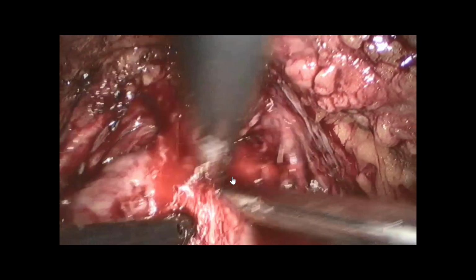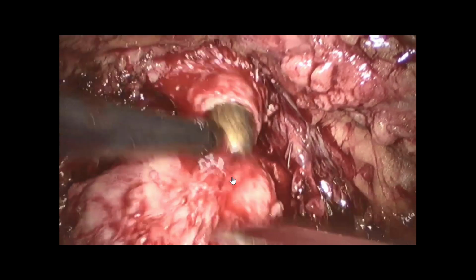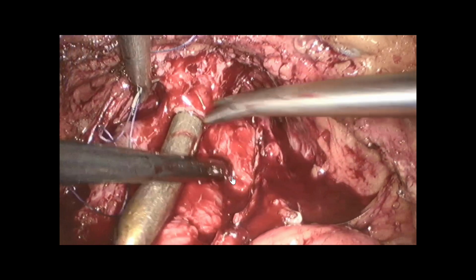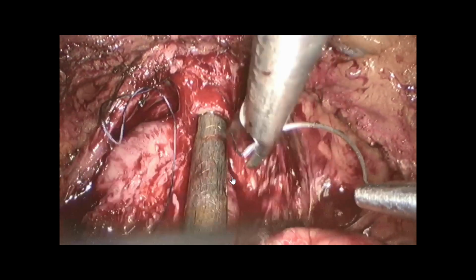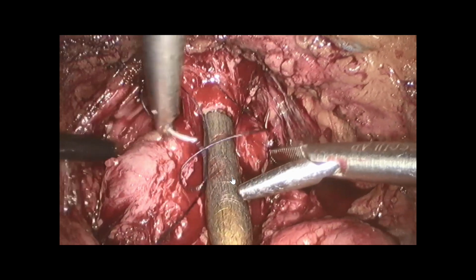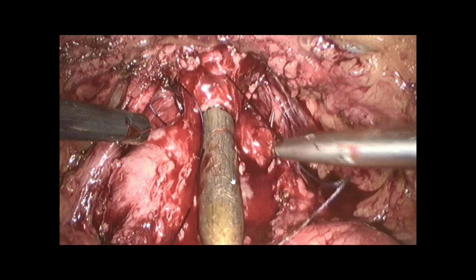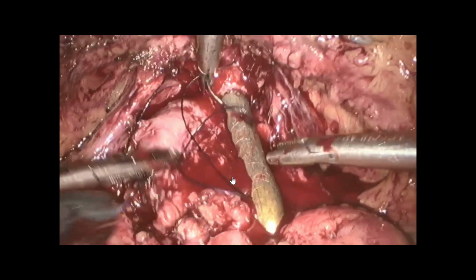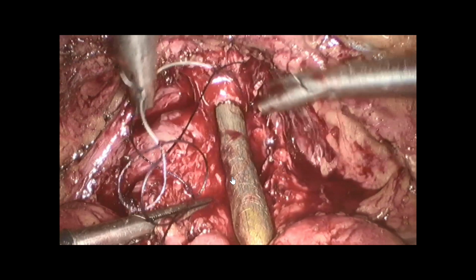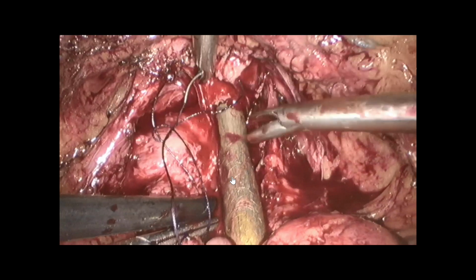And at that time, I was placing a Béniquet, metallic guide. Now I'm not placing it anymore. I'm just using the Foley catheter, but it was possible. And here, it's time to do the suture of the dorsal vein complex. And you see this suture is superficial. It's not going deep. It's just superficial, just to close the small vessel. So it's a 2-0 Vicryl with a 26 millimeter needle. And I'm doing a back-and-forth suture, just horizontal, just to close the small vessel.